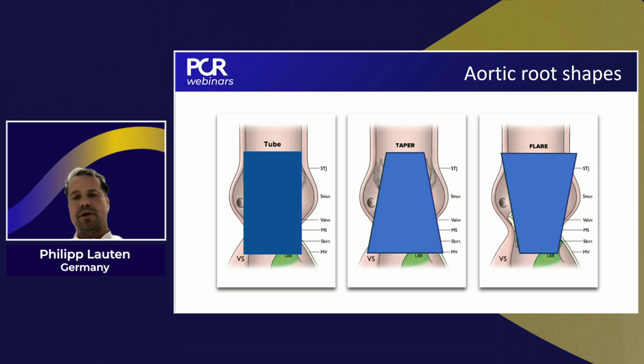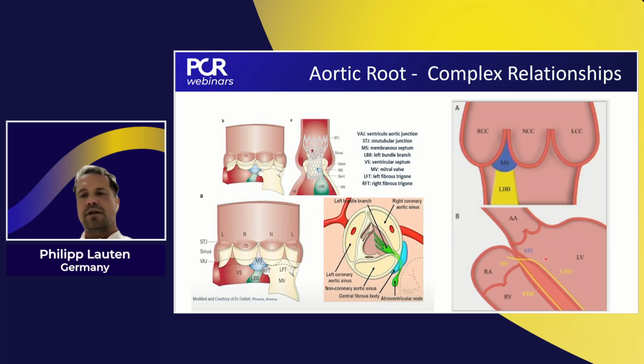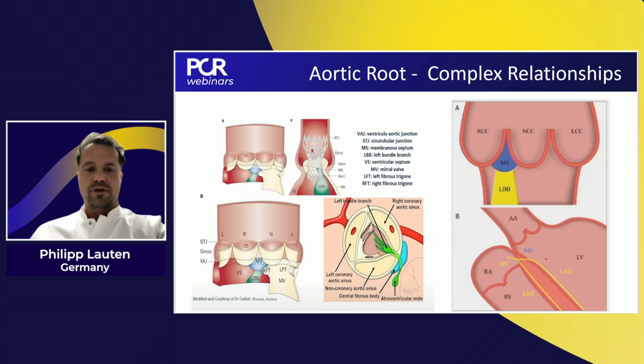and you have it in 3D reconstruction, you can play with the valve, even if you have on the other side maybe an LVOT calcification, put it deeper to avoid PVL, but also to avoid high gradient AV blocks or conduction disturbances, which leads to pacing or pacemaker implantation. So this is important for the screening, especially in small anatomy, because the place for the implantation of the valve is really narrow.